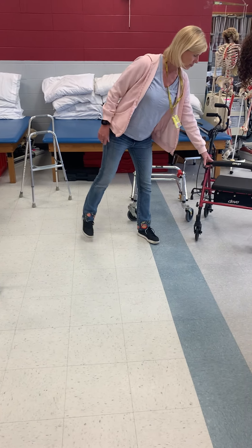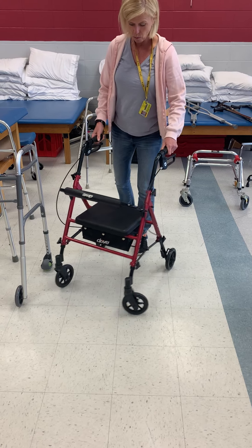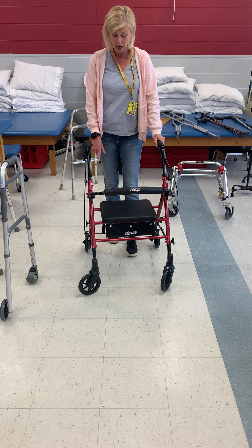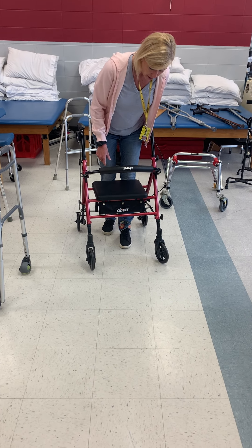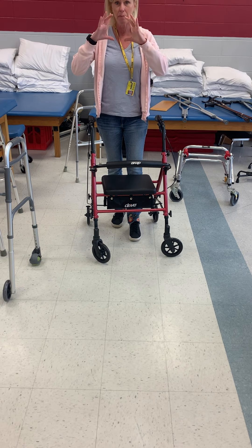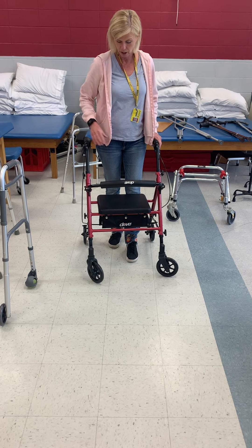This is a rollator — I call them the Cadillac of rolling walkers. The wheels are usually a little bit bigger, and in fact they can come much larger than this. These are probably about three or four inch diameter. They can be really big and have some tread on them too if you want to go outside.